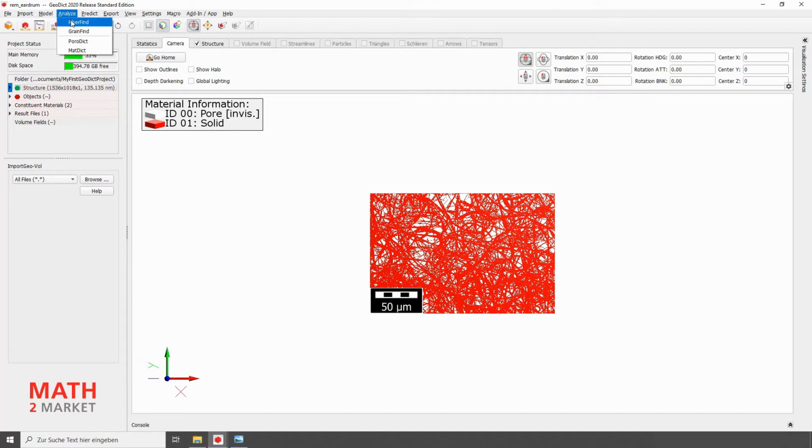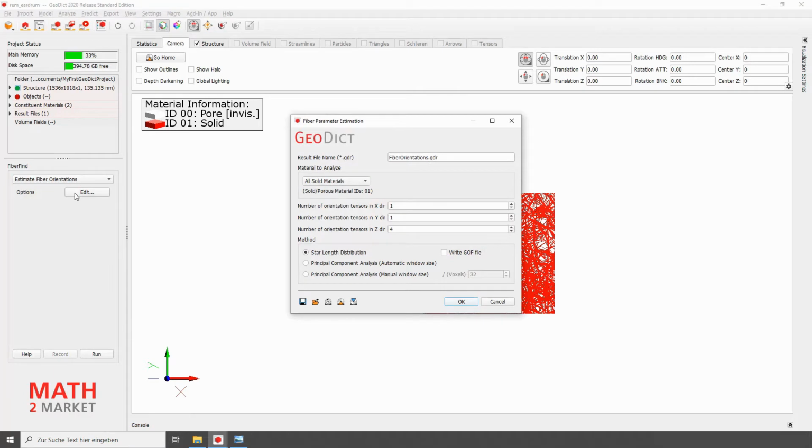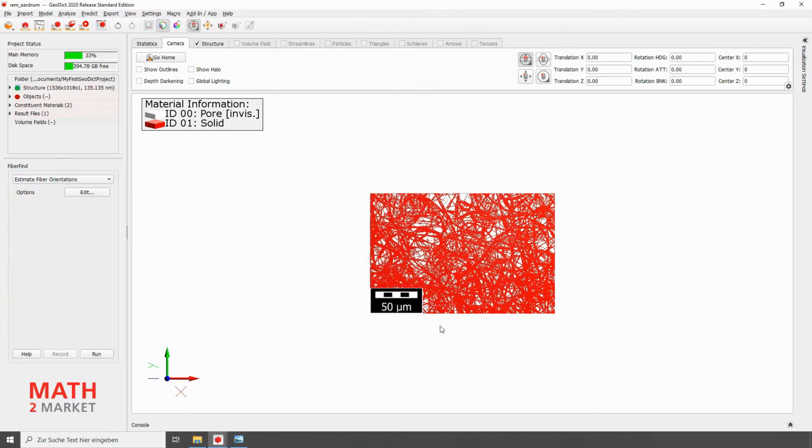Therefore, we select the module FiberFind, the function Estimate Fiber Orientation, and click on the Edit button. Here we can divide these structures into several subblocks, for each of which we can get an orientation tensor. In our case, we are only interested in one. For the algorithm, we keep the star length distribution because it also works in 2D. With a click on OK and then on Run, I start the analysis.